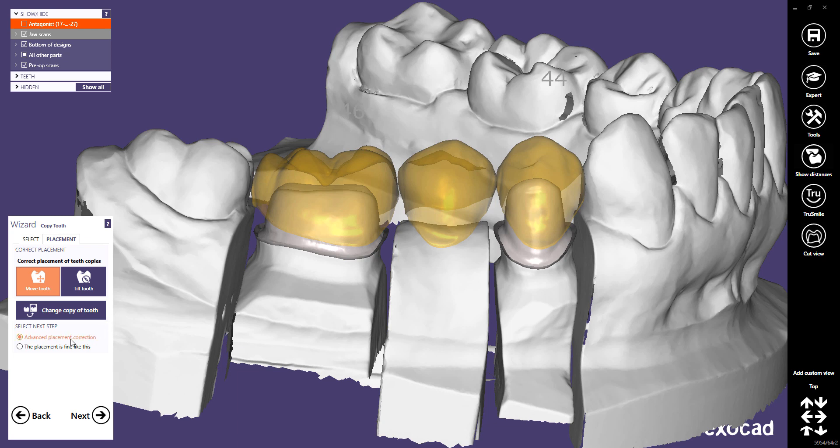Now you can select the next step. Advanced Placement Correction will open the Correct Pre-op Position dialog in the next step, allowing you to position every pre-op tooth individually. As we have already positioned each tooth, I recommend selecting placement is fine like this and skipping this step.